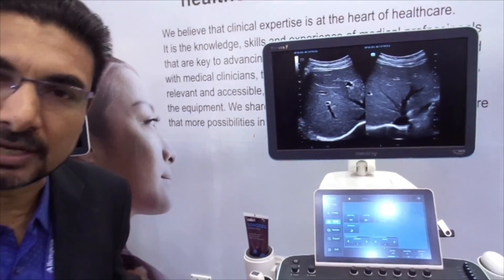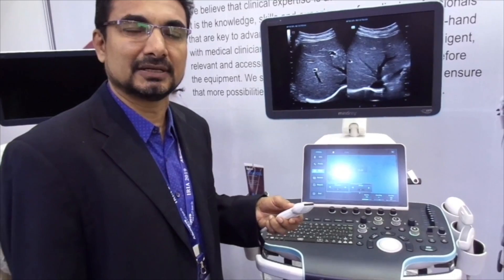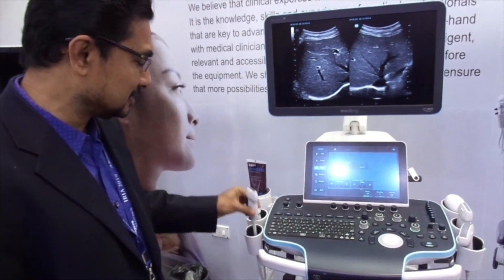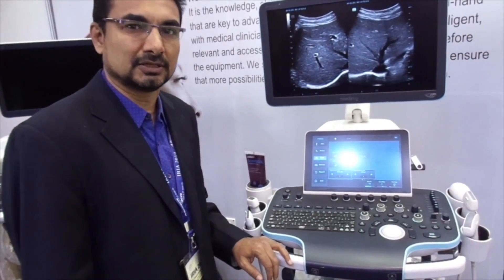It also comes with a 22MHz high-frequency probe for musculoskeletal work. This is as good as a hockey-stick probe, except the shape is slightly different. It is useful for all small parts — even finger vessels are seen — and the top-level image quality is quite good.